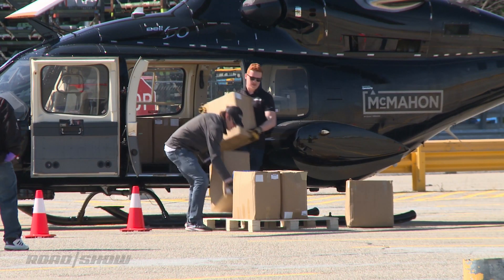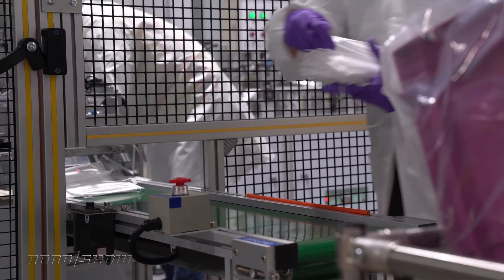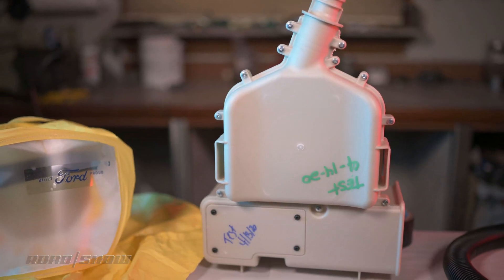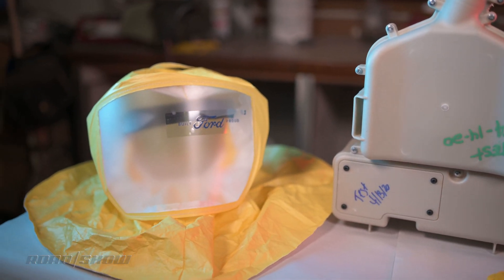With their factories idled and many workers furloughed, car companies have joined the fight against the coronavirus pandemic. They're putting their mass production expertise and engineering talent to good use, building things like face shields, ventilators, and of course respirators. And it's pretty cool that Ford was able to get us this demonstration unit on such short notice so we can show you what it is and how it works.